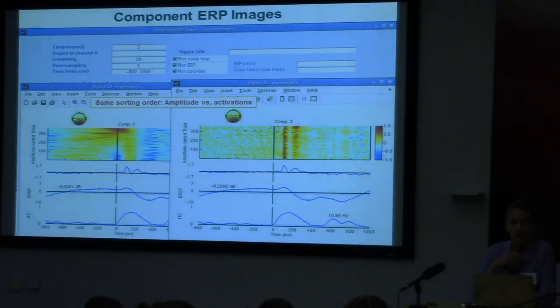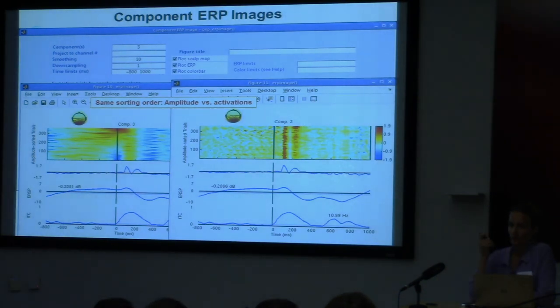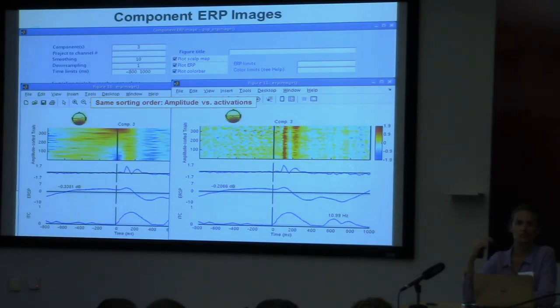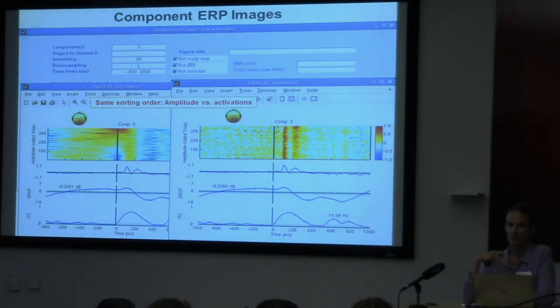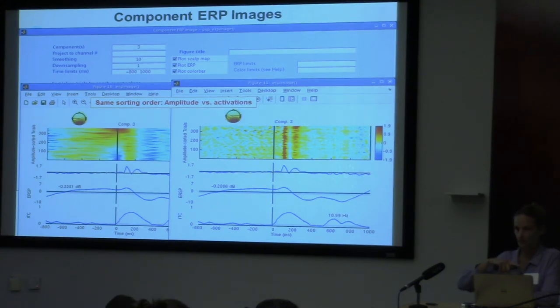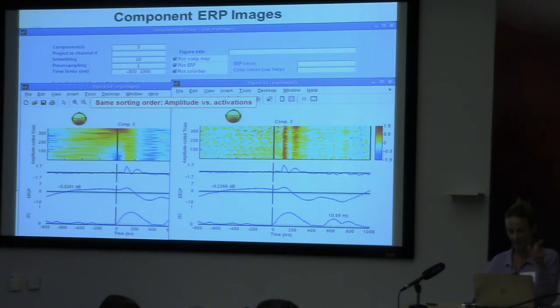To get the sorting values and trial identity, you have to do that from the command line using the erpimage function rather than pop_erpimage. You get a matrix of sorting values and can go back to the original data to know which trial is which. It can get complicated because all of these options are possible, but it's a very powerful function. When you run this from the GUI, this is one of the rare functions that — in addition to the history — will also always print out what the actual erpimage function call was, not the pop version, making it much easier to go to the command line.